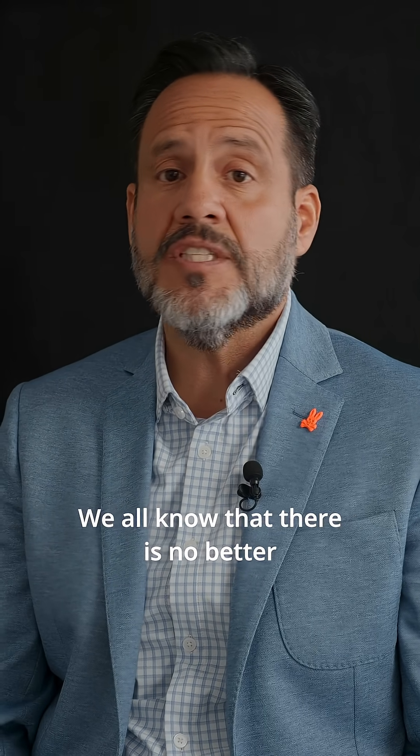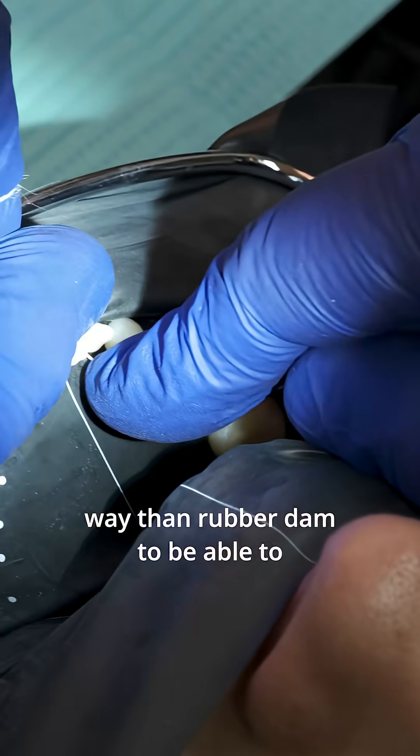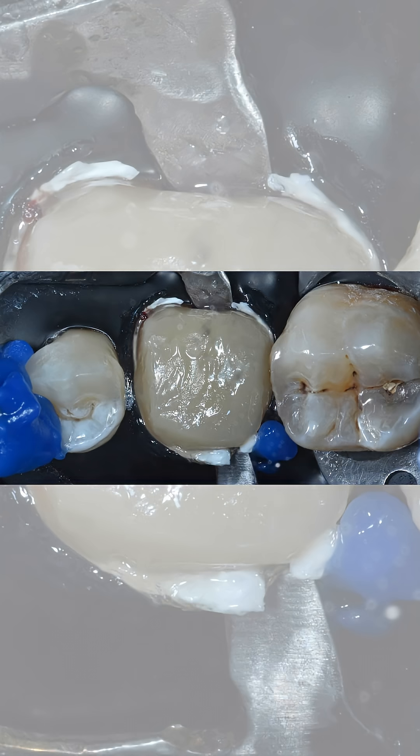We all know that there is no better way than rubber dam to achieve complete control of the operative field.